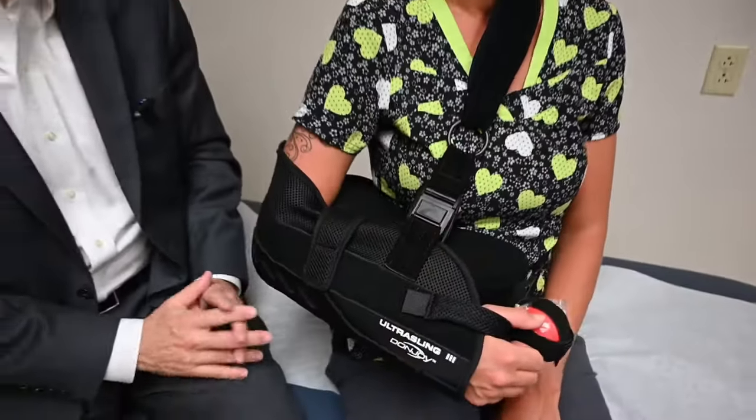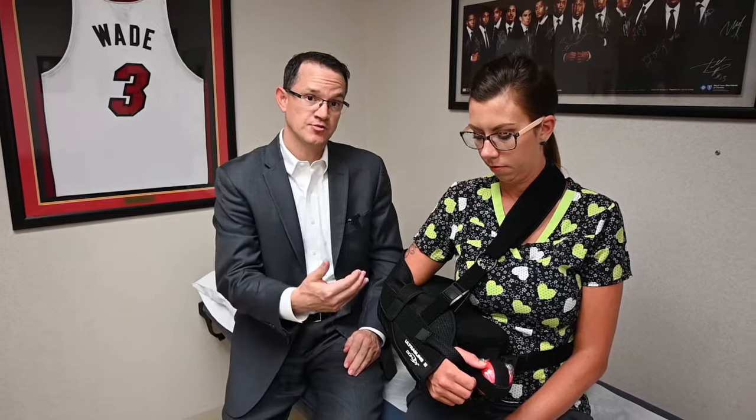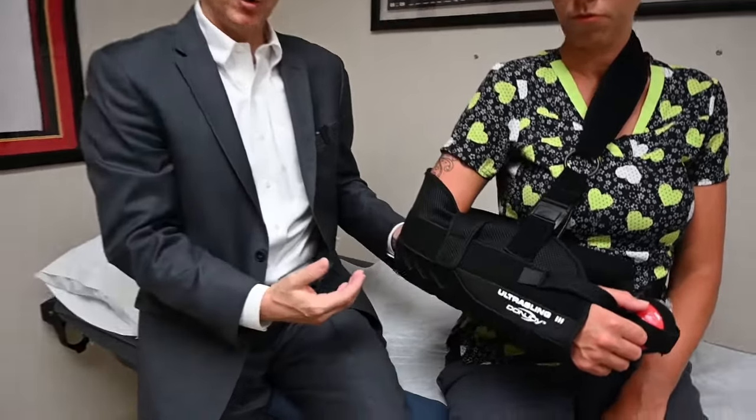I did not operate on your elbow, wrists, or fingers, and because of that we don't want them to get stiff. So once or twice a day I have patients remove the sling to do basic elbow, wrist, and finger range of motion exercises. In order to do that, you do not have to remove the entire brace.